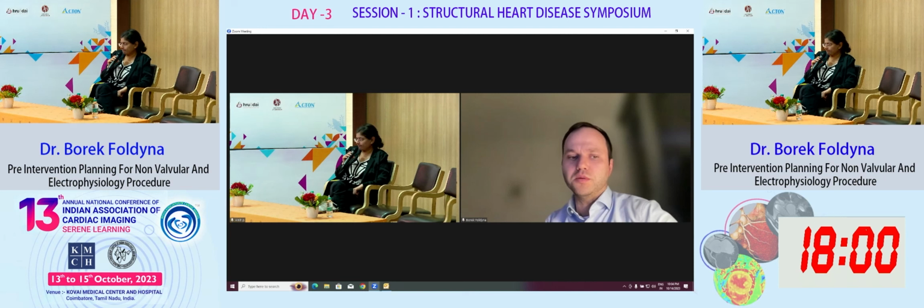We usually don't. No. So for the PVIs, there is this DECAAF study, but there was a lot of discussion whether it's real or not, and that's why everybody was so excited about the DECAAF2 study, whether it has a prognostic value, and it didn't. So you could see that it actually doesn't matter. So we really just describe the anatomy and rule out the thrombus.